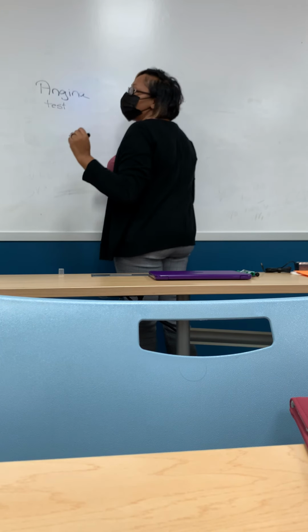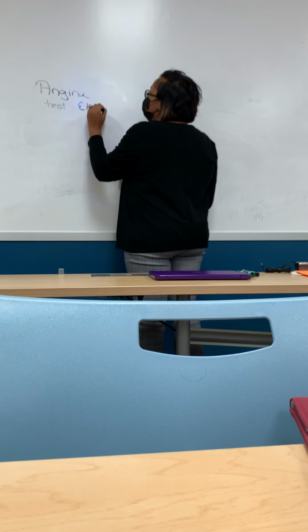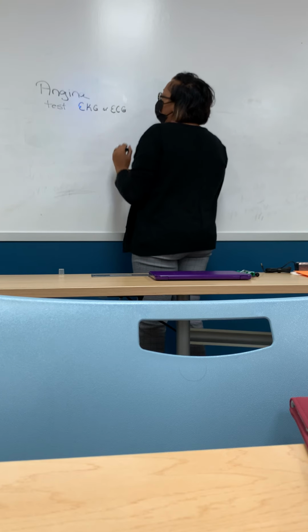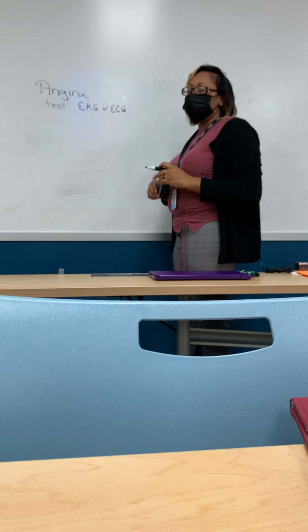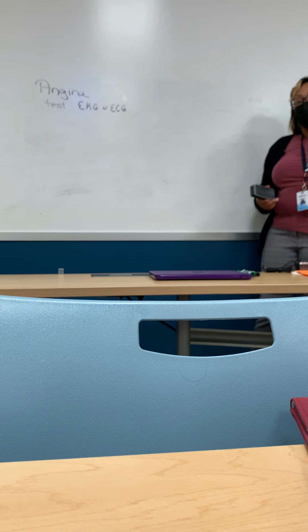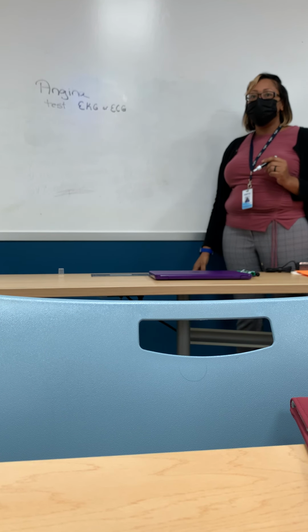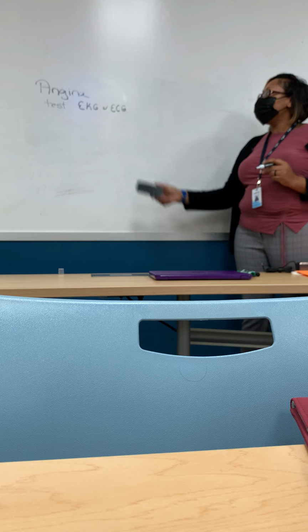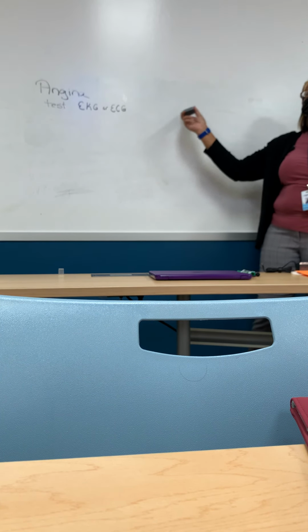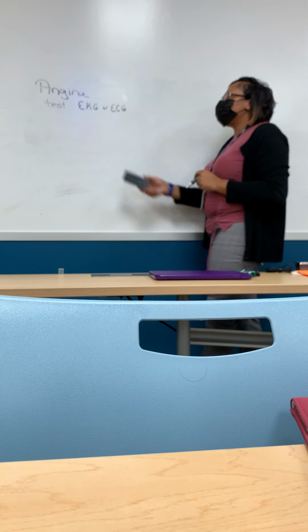Do you wanna do nitro first? ECG. EKG or ECG? It's both. You're gonna do that first? That's first. Why? Even though they're in pain, you're gonna do an EKG? What does this tell us? What is going on? We need to know, are they having an MI? Because if they're having an MI, door to cardiac cath lab is 90 minutes. So first thing we wanna do is look at the EKG.